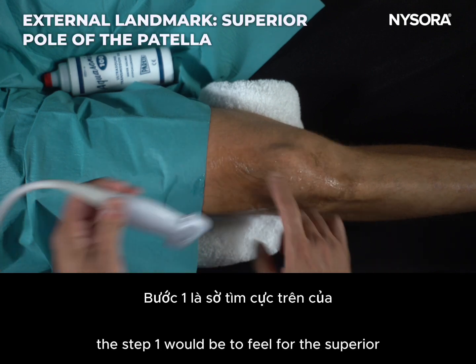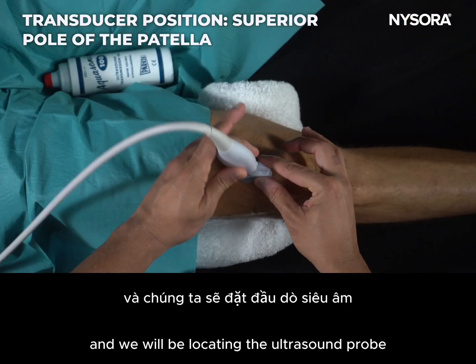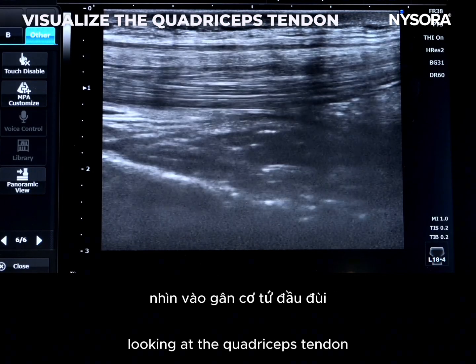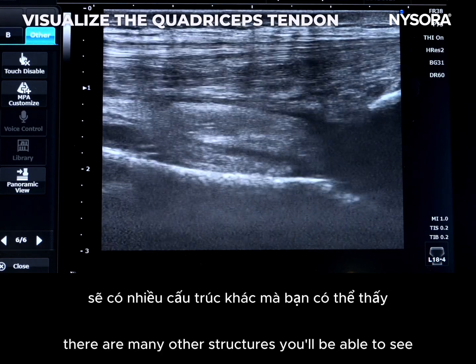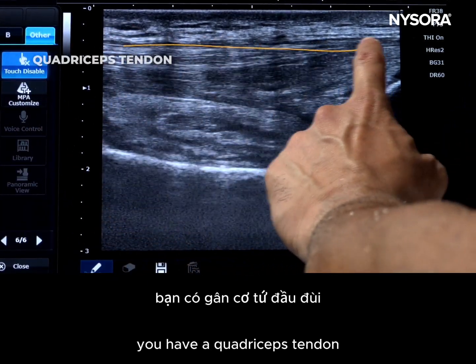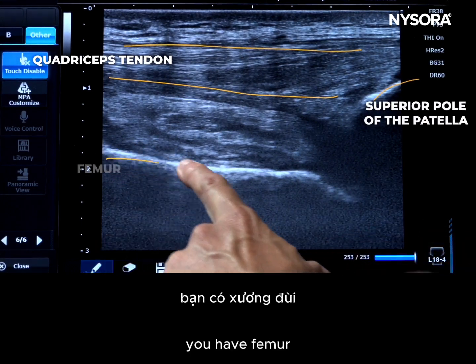Step one would be to feel for the superior pole of the patella, and we will be locating the ultrasound probe on the superior pole of the patella, looking at the quadriceps tendon. And once you locate the quadriceps tendon, there are many other structures you'll be able to see. So here on this particular image, you have a quadriceps tendon, you have the superior pole of the patella, you have the femur.